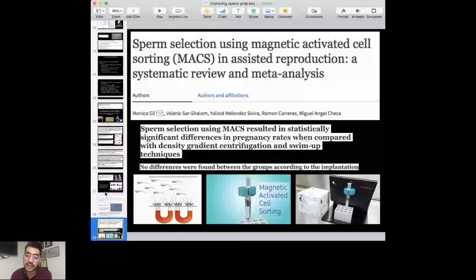But again, a staining test would probably be one of the best tests which I would routinely recommend, because you have documented evidence post that, which you can put on the report of the patient. You can give them an image of the fragmented sperms and the non-fragmented sperms. And that's something that, again, actually appeals to the patient as well.